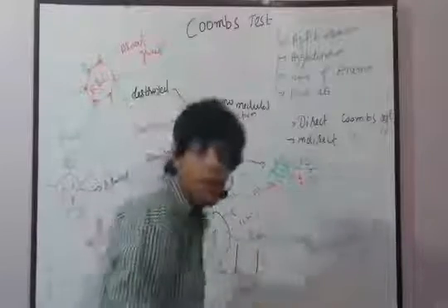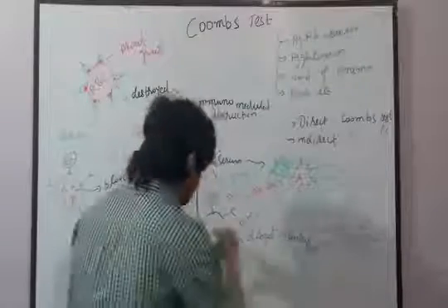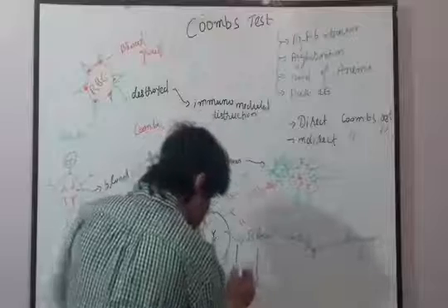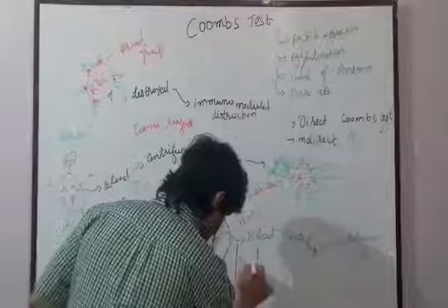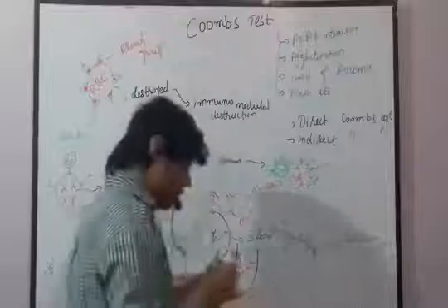Inside the serum, we have the antibody, not the RBCs. So we have the antibody of this mother. Let's suppose these are the antibody that we separated. So these are the antibody.